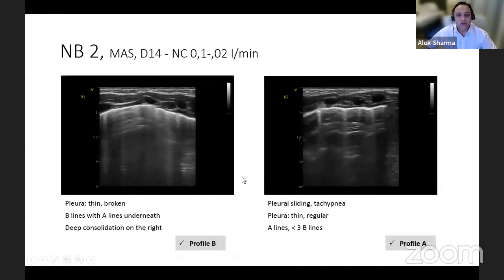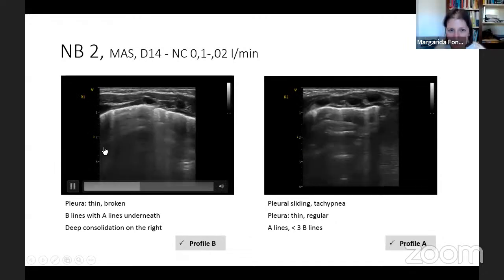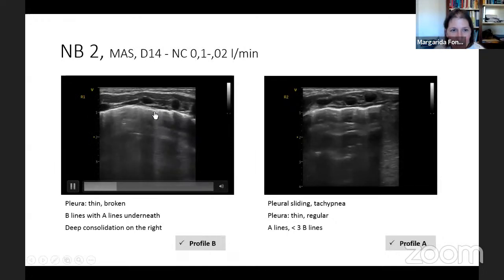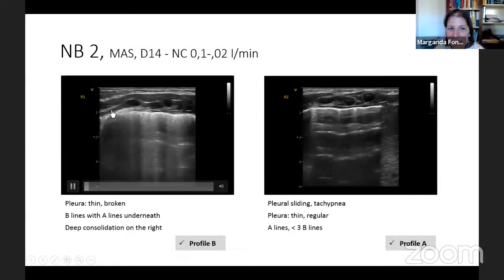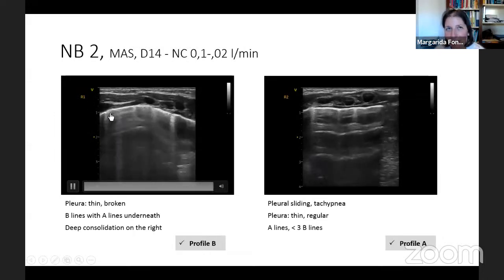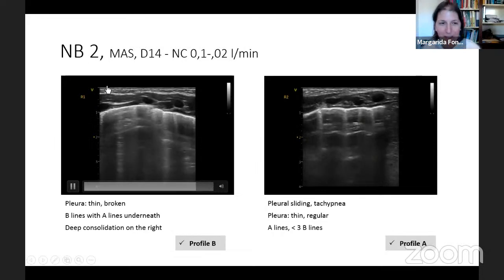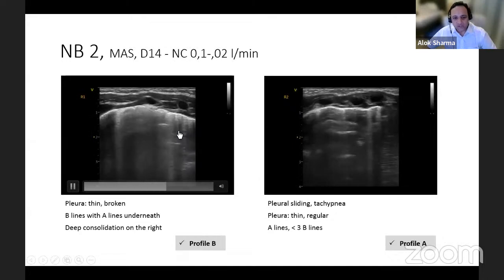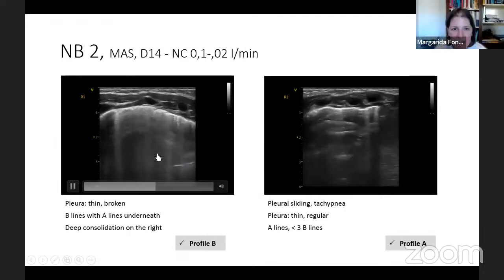So if you were to follow our guideline and report from the pleura down, you've definitely got pleura all the way through. What do you think? Regular, continuous in R1? I think it's a bit irregular, some broken here. Maybe it's not thin, it's a bit thick. Yeah, it's a bit thick. I shouldn't say that it's linear, right? Sure, fair point, I think you're absolutely right. It looks a little bit on the coarse side. Definitely, once you've seen sliding, what about sliding? Yeah, I think it's sliding.